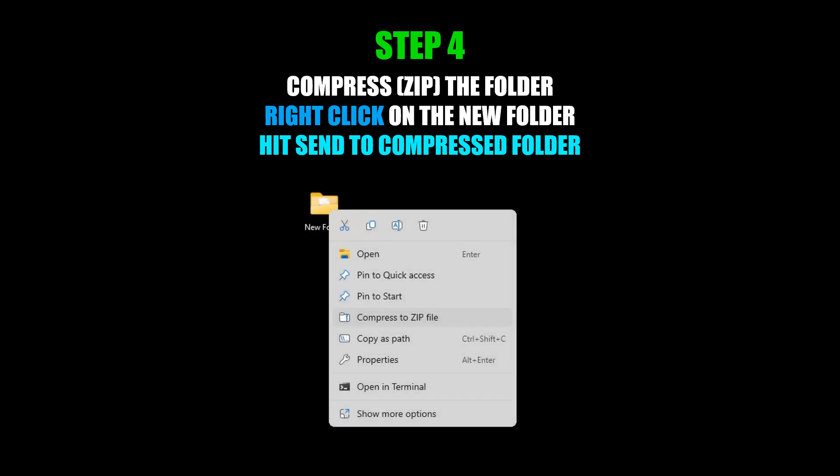If you have the newer version of Windows, you might see a screen that looks slightly different, with a Compress to ZIP File option.